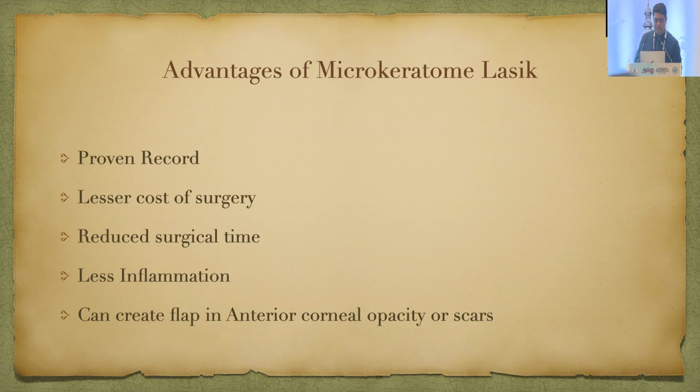So we have advantages with microkeratome LASIK: it has a proven record, there is lesser cost of surgery, reduced surgical time, less inflammation, and it can create a flap in anterior corneal opacity scars also.